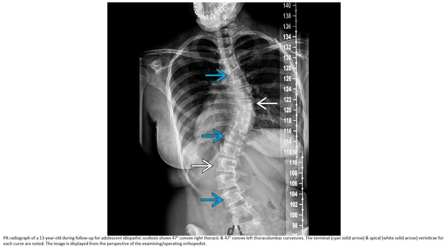PA radiograph of a 13-year-old during follow-up of adolescent idiopathic scoliosis showing a 47-degree right thoracic and 47-degree left thoracolumbar curvature. The terminal and apical vertebrae of each curve are noted. The image is displayed from the patient's perspective, meaning the left side corresponds to the patient's left.